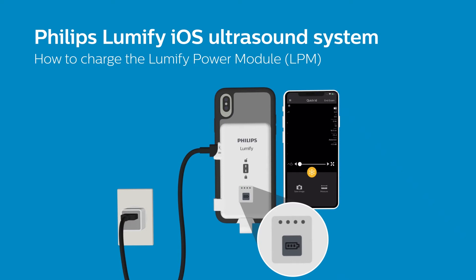Once charging, notice the LED indicators on your LPM light up. There are four LEDs that indicate charge level in 25% increments.